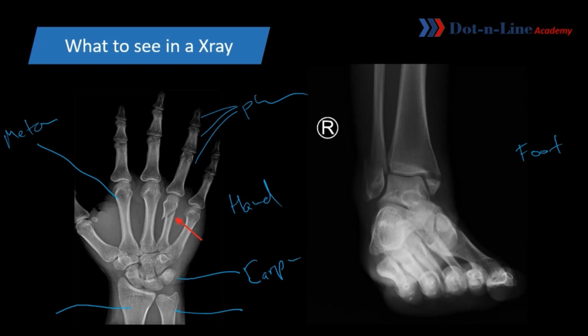If I say that this image is taken from the anterior palmar side, in that case relate it with your hand. See both your hands from the palmar side. In which hand the radius is lateral? In the left hand, right? So this is left hand X-ray.